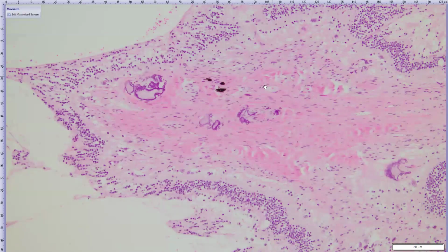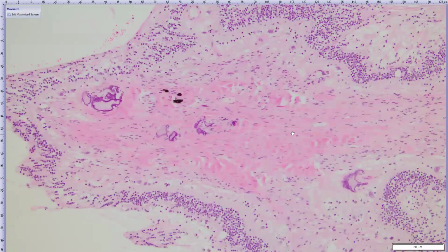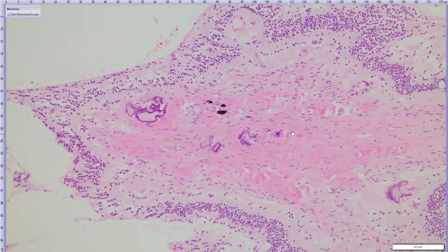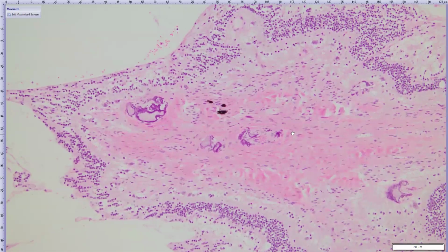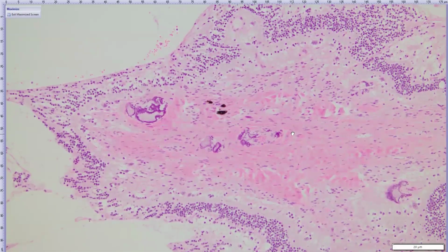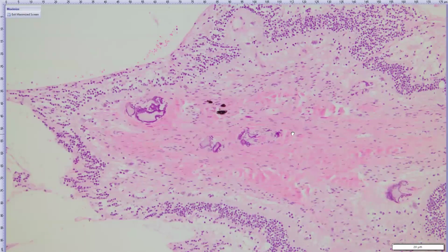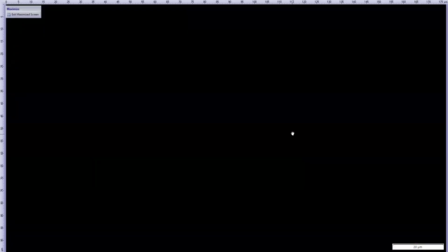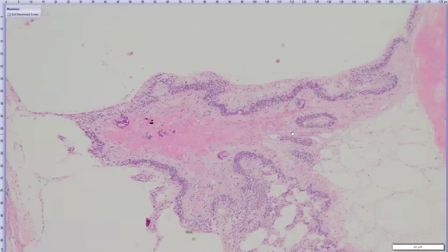In addition to that, there's also some mineralization of the walls of the retinal vessels, which could represent a dystrophic mineralization. So just tissue damage and necrosis, and you get deposition of calcium salts on that necrotic tissue. Sometimes we'll see more metastatic mineralization, so calcium phosphate imbalances, in animals with renal insufficiency or hyperparathyroidism, things like that. In this case, they didn't mention anything in terms of medical conditions that might suggest metastatic mineralization, so I wonder if it's just a dystrophic or reactive change.